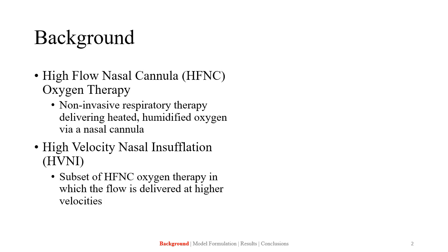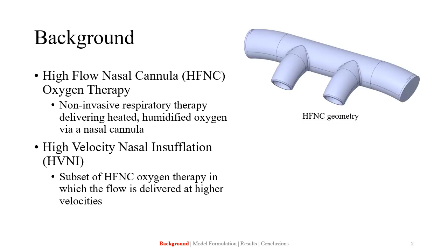Some quick background. High-flow nasal cannula oxygen therapy is a non-invasive respiratory therapy in which heated and humidified oxygen is delivered via a nasal cannula geometry such as the one pictured on the right. Flow rates of HFNC oxygen therapy are up to 60 liters per minute.